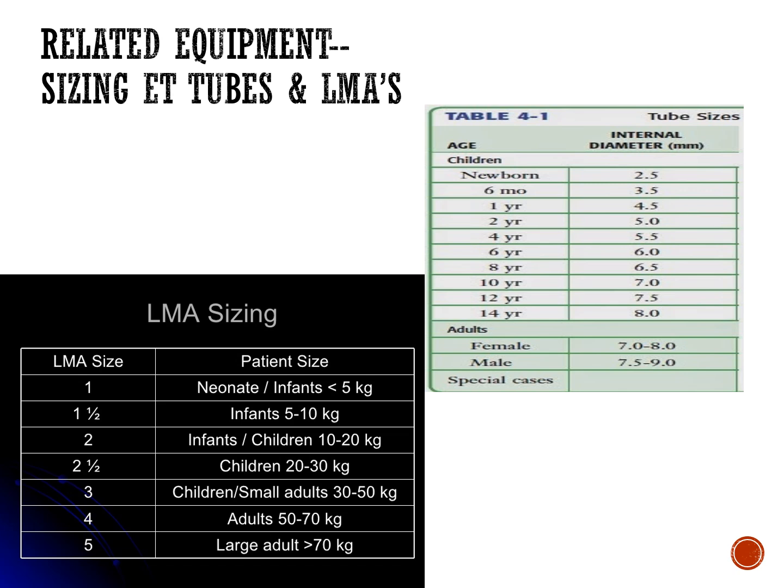Typically, an 8.0 subglottic will have a bigger circumference and will be closer to an 8.5 non-subglottic. It's a rule of thumb, not a hard and fast rule, but be aware that it may be nominally more difficult to intubate. If you're intubating with a subglottic 8.5, it may be closer to a 9. So just something to keep in the back of your mind.